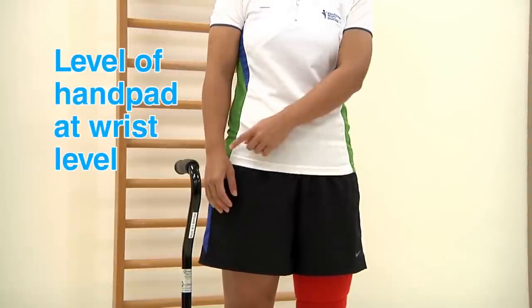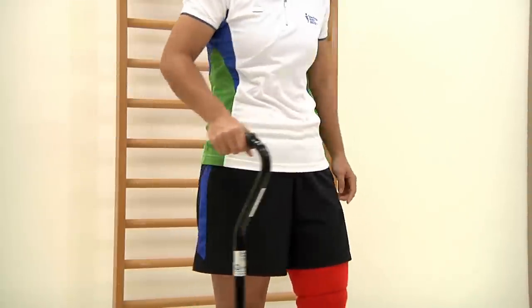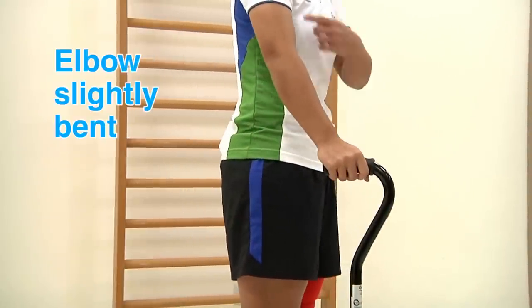The level of the hand pad should be at the level of your wrist. When you place your hands on the hand pad, your elbow should be slightly bent with the stick 45 degrees in front of you.